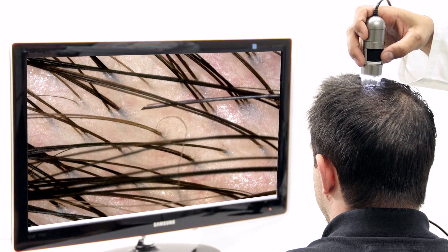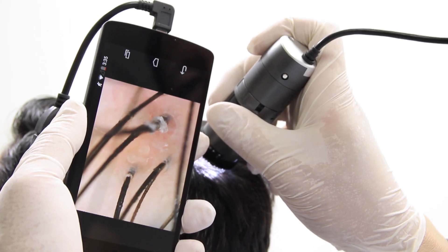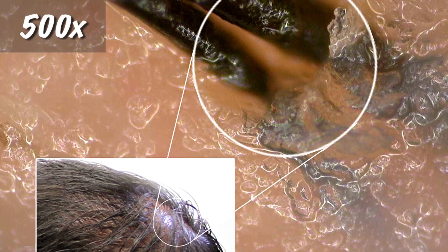Many USB models can use Dynolite Wi-Fi accessories to use iPads, tablets, smartphones, or laptops as a viewing screen wirelessly. Some models and compatible Androids can use an app and adapter to connect directly.